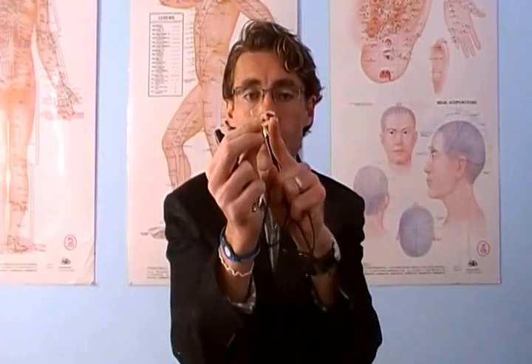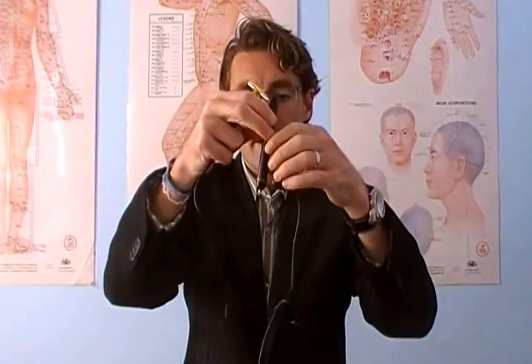Okay, the hammer stem probe is this. Now, to be honest with you, I've really never used it before until just recently, so I can show you how to use this. It comes in 2 pieces. First, I don't know if you can see this, it comes with this little brass ring with a little bullet and a little knob here. And the second thing is the hammer right here. What you're going to do to use the hammer stem probe with the Piezo Pen is to put it on just like this. Fit that little bullet nice and tight right in that hole. And then with the little brass knob, you're going to bend it down. It makes the circle a little bit bigger. You need to put the Piezo Pen right in there.